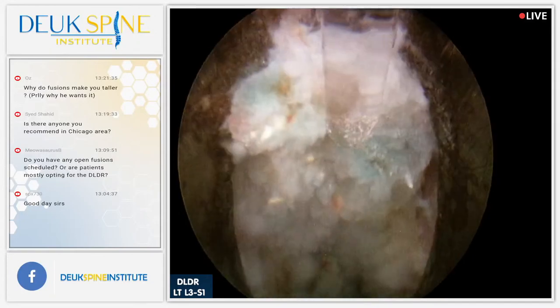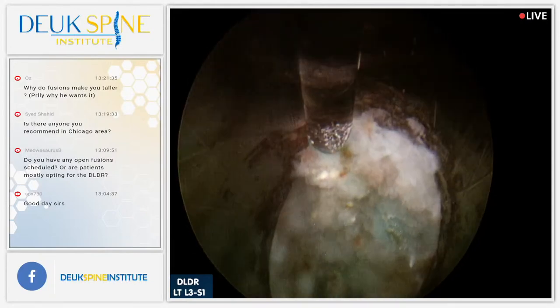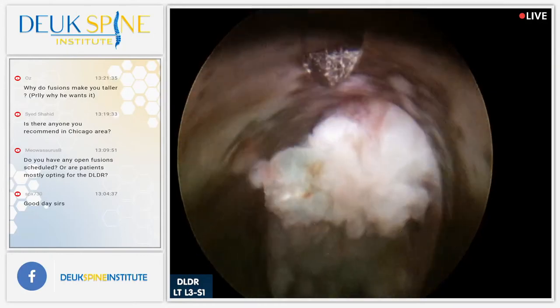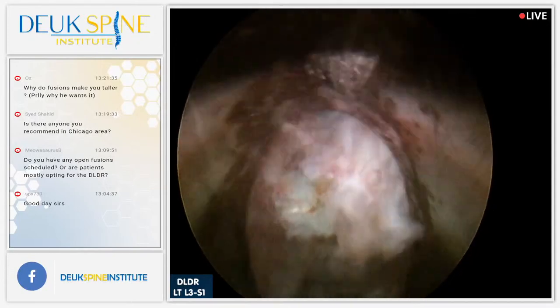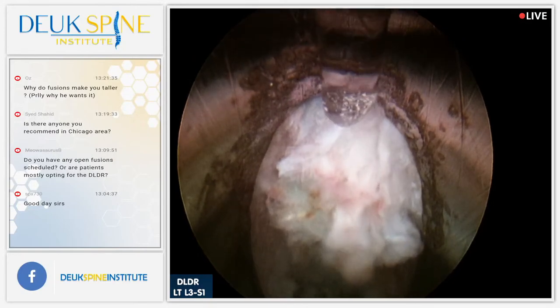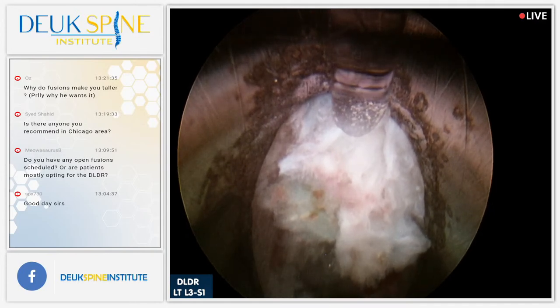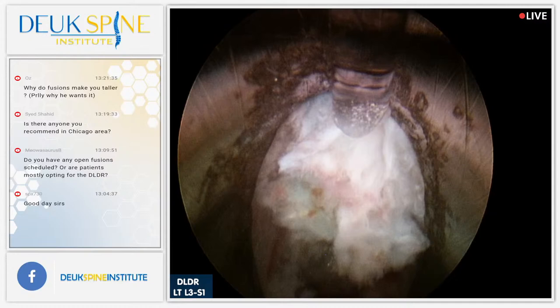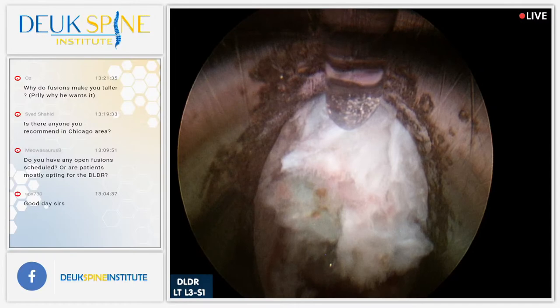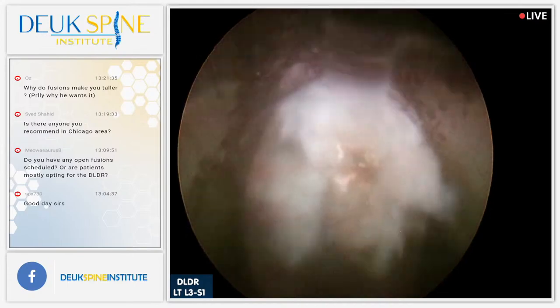All right, looking good. You guys can see the granulation tissue right there. You see the pink color and the pink color over there. That is where the back pain comes from. Granulation tissue. There it is right there. Man, that's a pretty good one right there, Henry. I've got to say, let me shut off the irrigation. Get ready to take a few pictures. Copy that. Bam, do it. Dude, I like that one. Maybe we use this as well for the paper. Can you get that right there? I got it. And then the irrigation back on, and we're going to blast it.